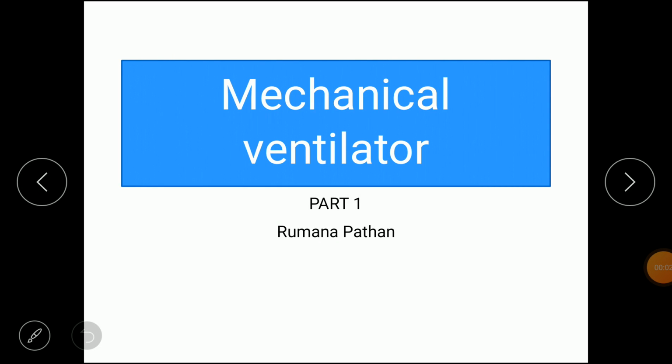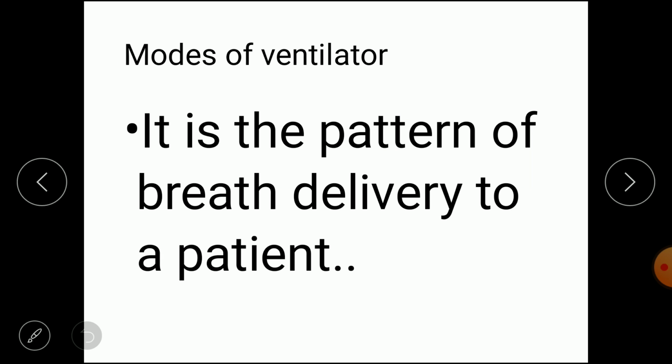In this video, we are going to talk about the mechanical ventilator. Generally, in which condition is a mechanical ventilator used, and which types of modes are used in mechanical ventilation? Okay, so first we see what is a mode of ventilation.